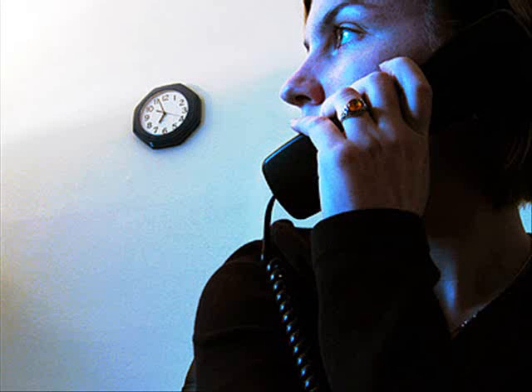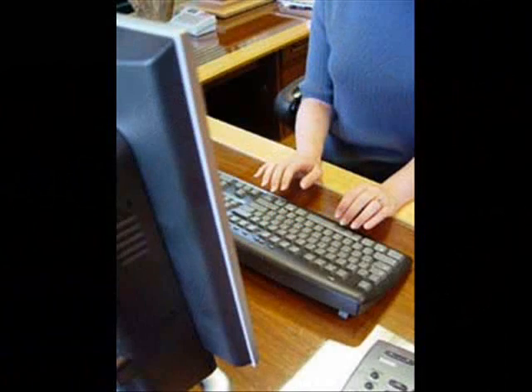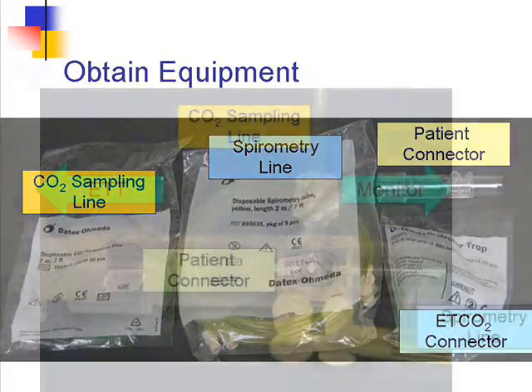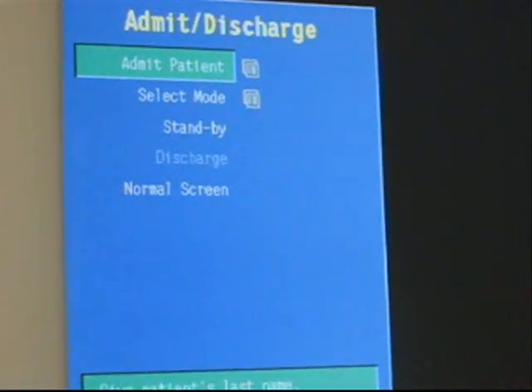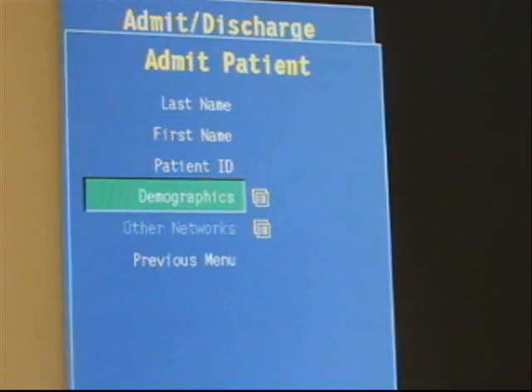Ensure that other personnel is notified as appropriate, including the preceptor to whom you are assigned. Document appropriately, and ensure that you are correlating the findings to the patient condition. By a thorough review of the equipment, its placement within the system, as well as some of the procedural steps outlined in this competency-based objective video, you should be successful in the challenging of this CBO on indirect calorimetry.